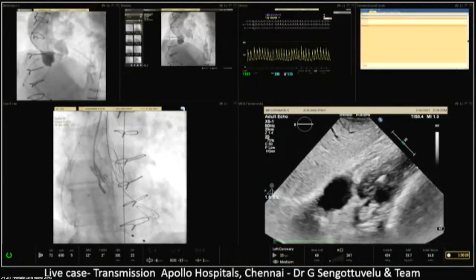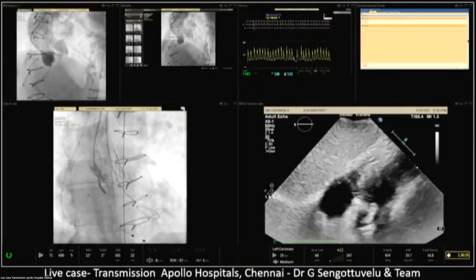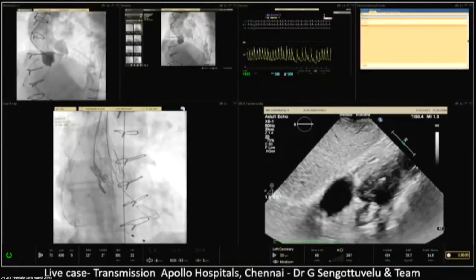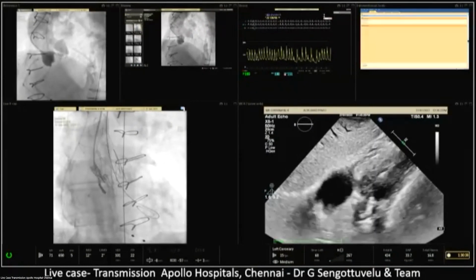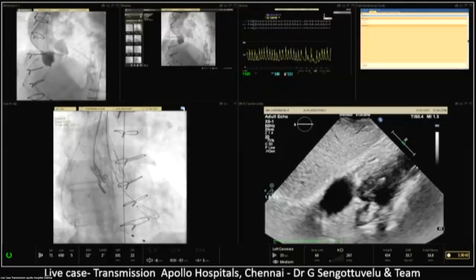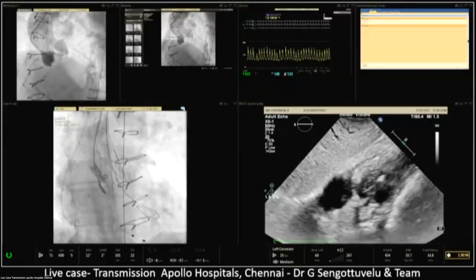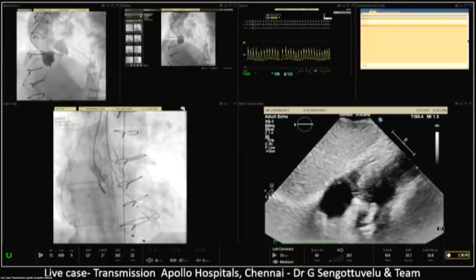At the moment, there is some risk for dislocation, and this could be really a disaster for the patient, because what would you do then? Emergency approach will be probably, I think I will probably put one more valve and fix it, maybe leave it more. I think that will give us more confidence. So maybe, as you said, maybe it'll stay, but I think we'll decide to put one more valve. Get the pigtail in. We're going to put one more valve. I would recommend you to go with the second valve and to achieve a perfect result.